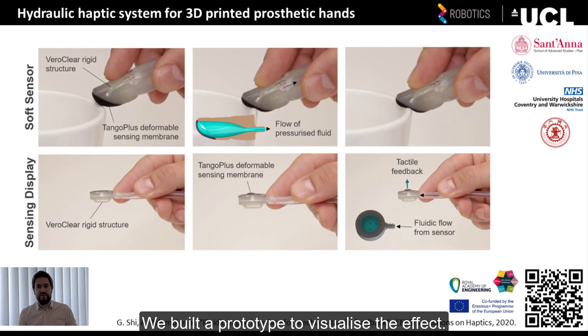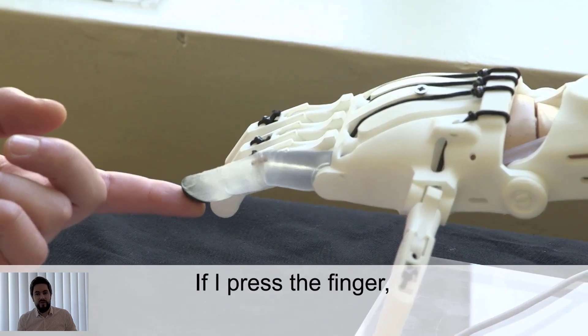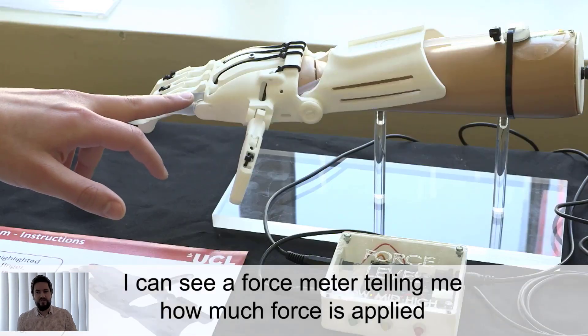We built a prototype that helps to visualize the haptic feedback effect. Now, if you press the finger, I can see a force meter telling me how much force is applied, seen by different LED lights in this video.